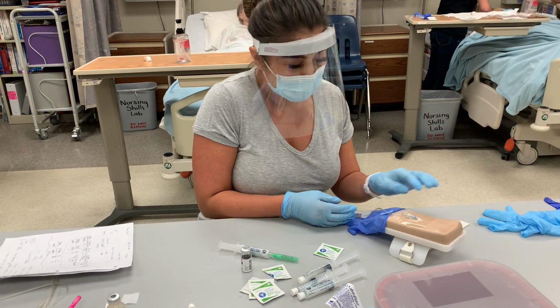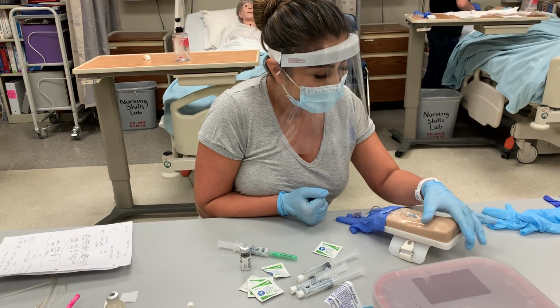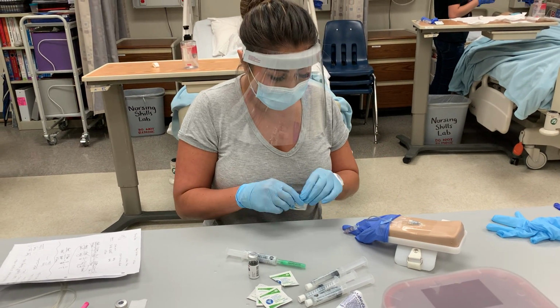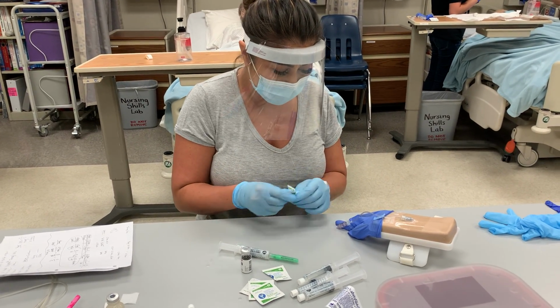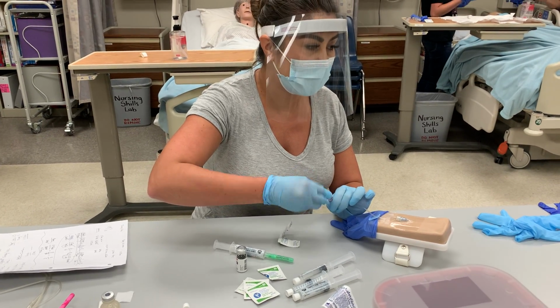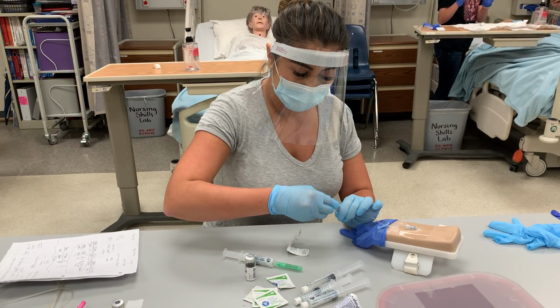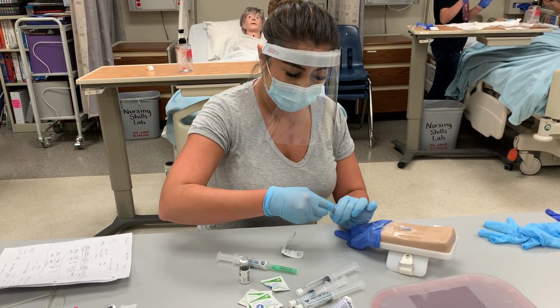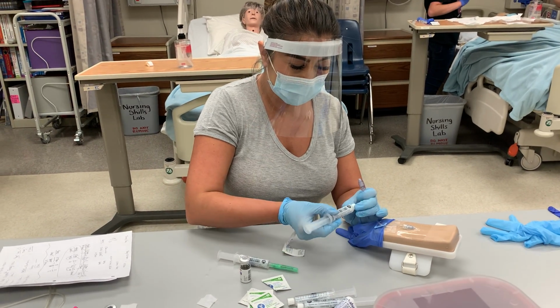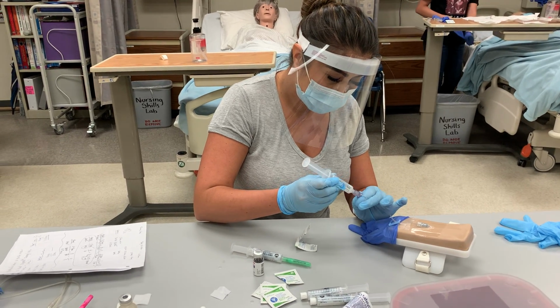So I would assess the IV site, make sure there's no phlebitis, no inflammation. It's not cold to the touch. It looks good. So I want to verify patency. So I'm going to go ahead and clean this. I'm going to scrub the hub for 15 seconds. I'm opening my swab and dropping it in my sterile field, so it's already there. Okay. And I'm going to take my saline flush.